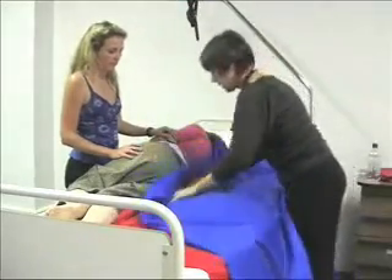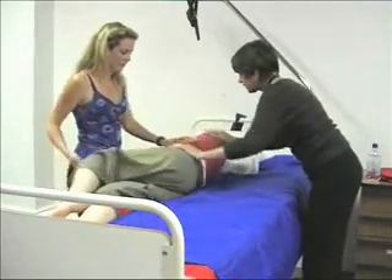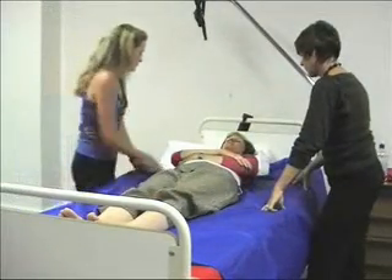The process is repeated for the second sheet. Remember to pull them through on the other side once you have laid the patient flat, and use bed mechanics so gravity will assist your move.